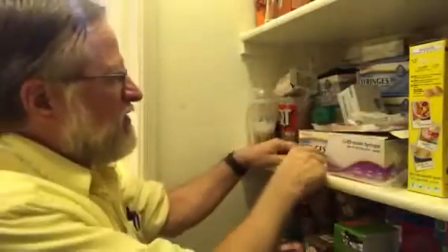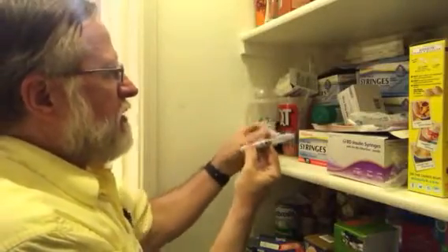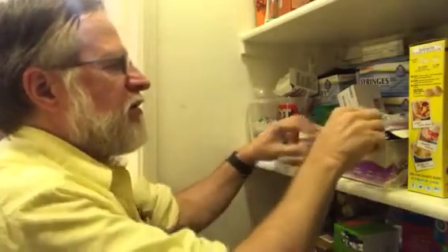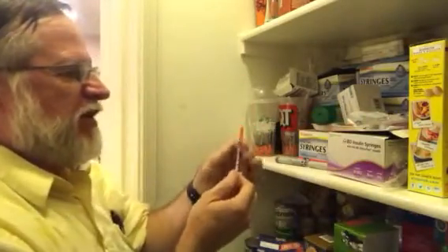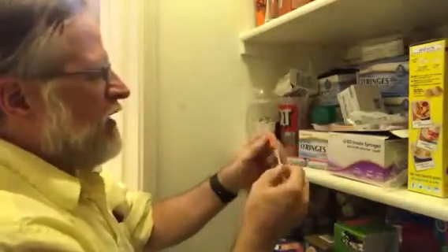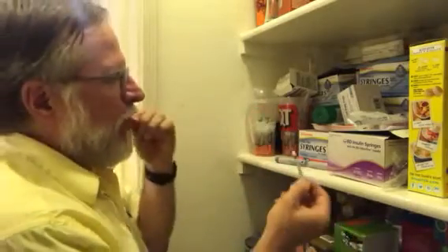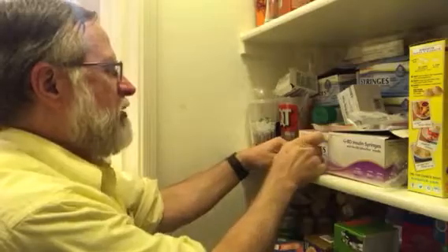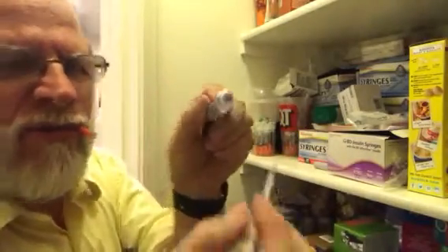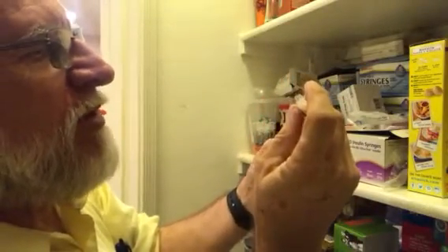So this is how we can use this dispenser of insulin with the syringes. You can just take the cap off the back of the syringe and put that out of the way. You can take off the hold and twist to get that off. And then you just take this off and we've got a little rubber membrane there.